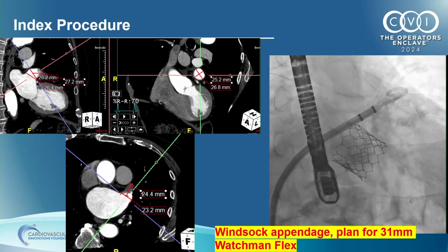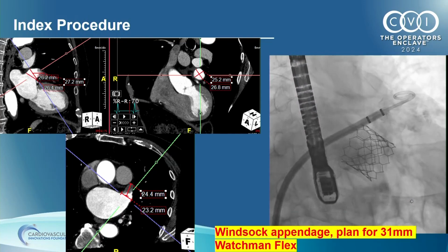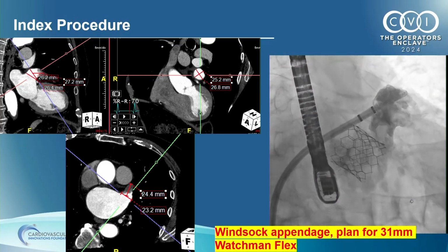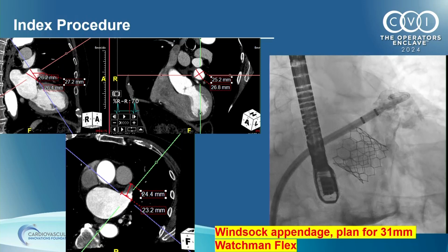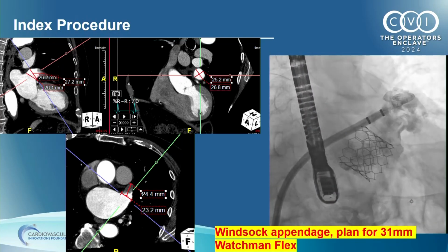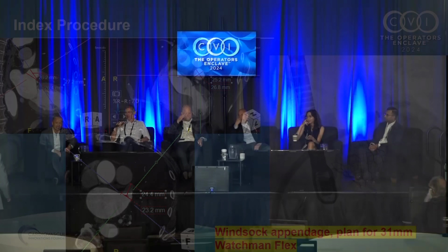I would have probably tried not just putting 31 up, but if that does not work, put it in the posterior lobe and see if it covers up. Yeah, it's a good thought. Usually, though, with the posterior deployment, you're going to end up with a giant shoulder. It always seems like it would make sense, but the problem is it almost always gives you a huge shoulder. Well, then you can put your coils in the other lobe.